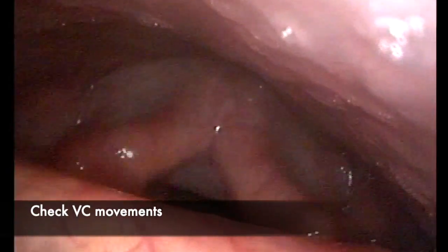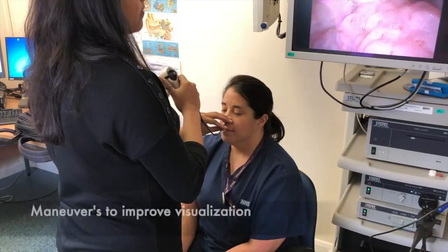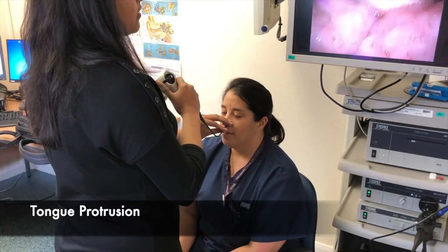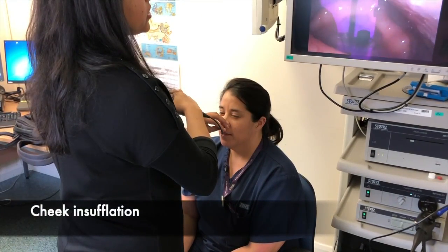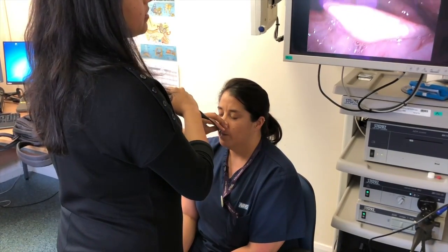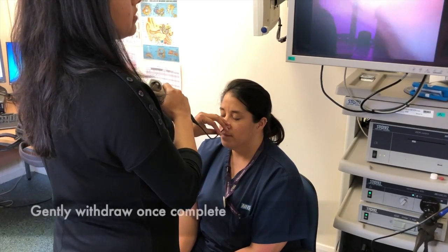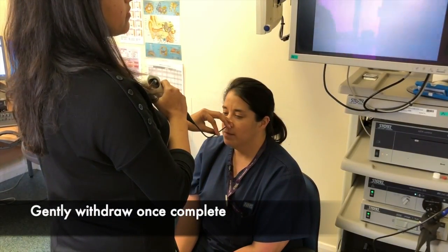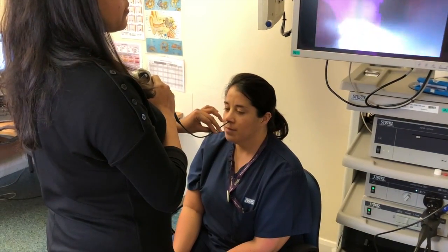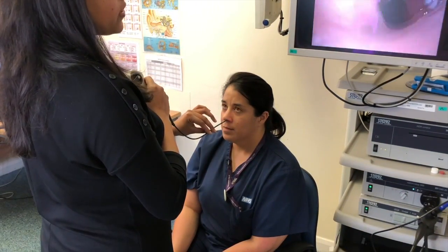You can ask the patient to make a sound to check vocal cord adduction and abduction. Then carefully look around the remaining aerodigestive tract. Tongue protrusion, cheek insufflation, and turning the head left and right or moving the endoscope can help visualize all parts of the upper aerodigestive tract. When finished, withdraw the endoscope gently.